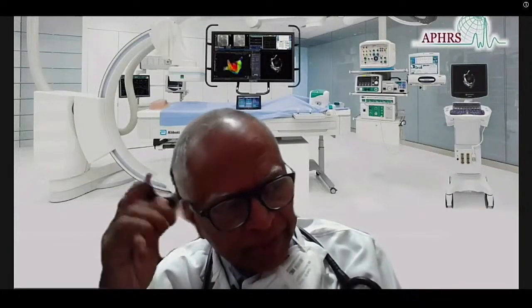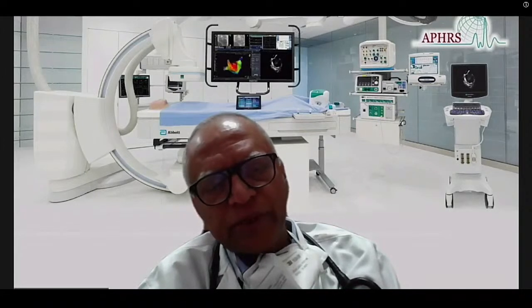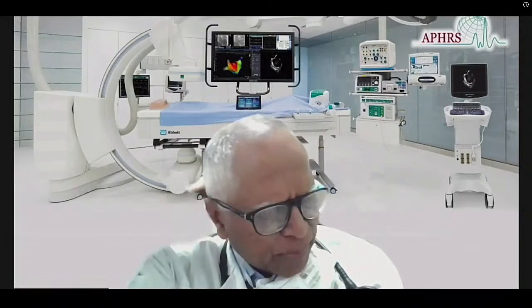Number one is to keep this patient very well sedated. And even during AFib, if you have roughly localized where the pathway is, the ventricular insertion will be very early. So even when there is a varying cycle length, you need to quickly learn to map the earliest V and ablate this even during atrial fibrillation. There are some patients who will be repeatedly going into atrial fibrillation. The moment you ablate the ventricular insertion or near the accessory pathway, everything will be gone. So that is one thing.